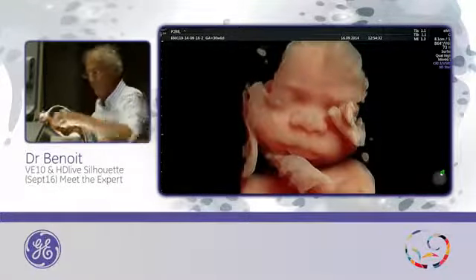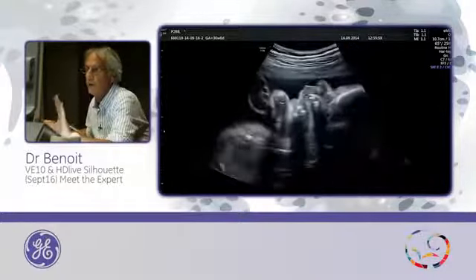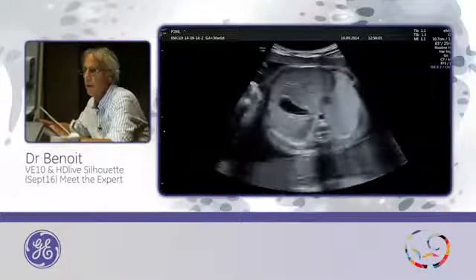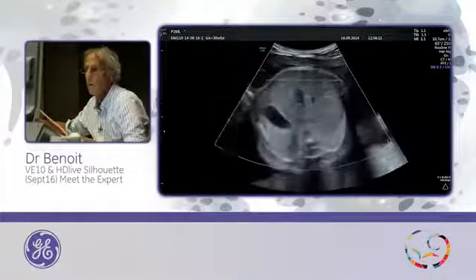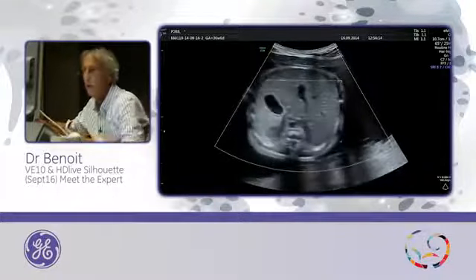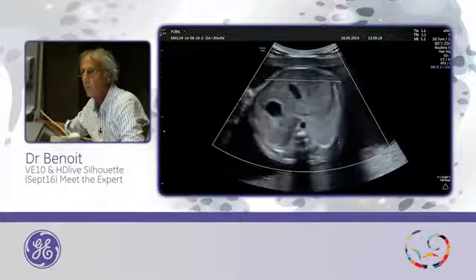So this is okay, but I will show you silhouette. It's better to use in the first trimester of the pregnancy, but also you can use it. I will do it on the abdomen here. I will take a volume of the abdomen, surface, quality, high, angle, okay, and if the baby is not moving, I will start.